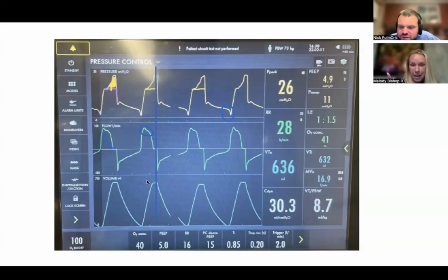The patient's pulling spontaneously, so they're going to create more negative pressure, and the pressures that we're applying are not that bad. Realistically, the tight alarms that we would need here would probably be minute ventilation and tidal volume. For pressure control, I don't see what our volume alarms are. Is there a volume alarm, or is it just an MV alarm for pressure control?